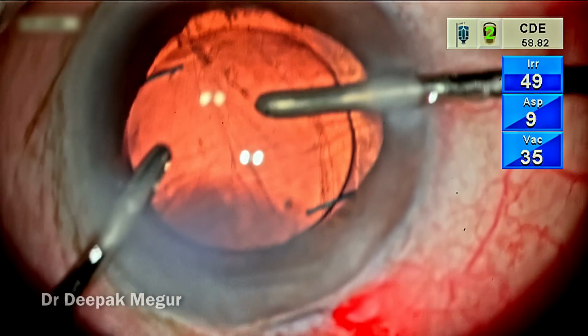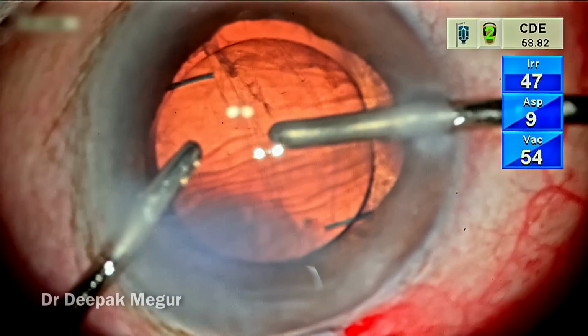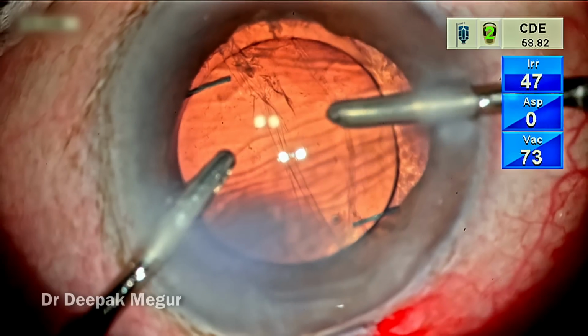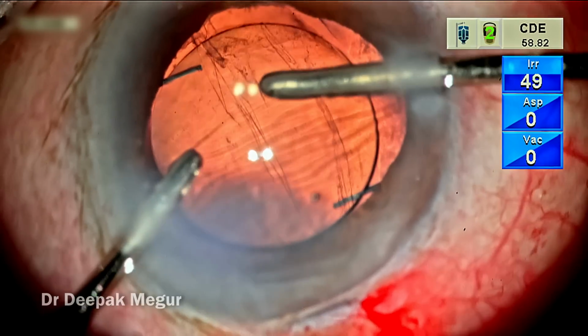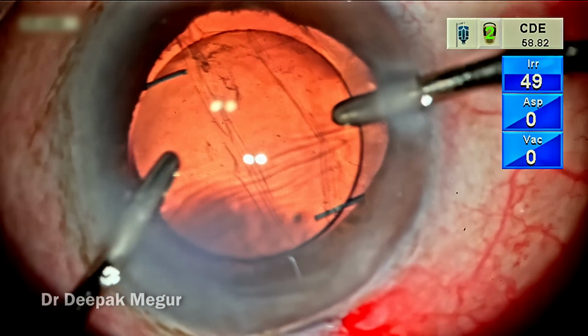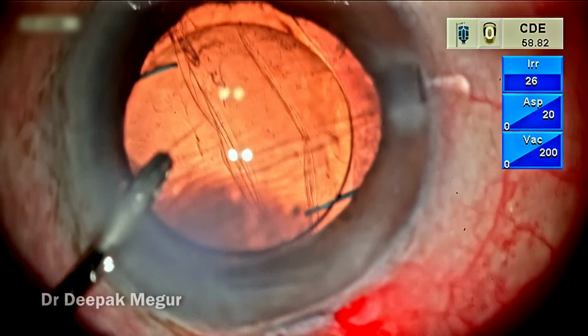So I thought, let me try and remove that little patch of cortex which is there. Well, in hindsight, I realized this was not such a great idea, simply because the cortex is sticking very firmly, it is very little, and it is sticking onto a capsule which is not at all stable, and it is wrinkling and folding.